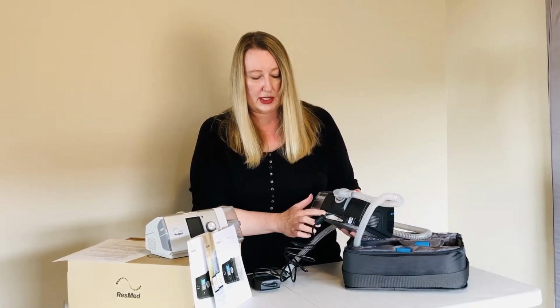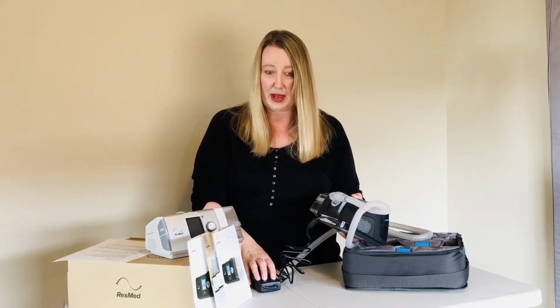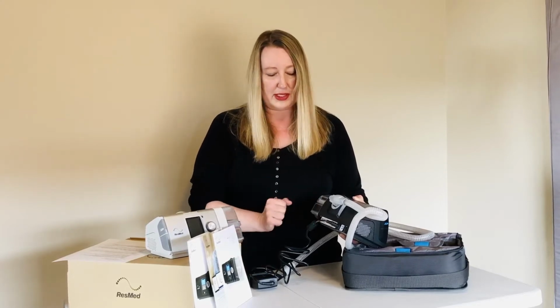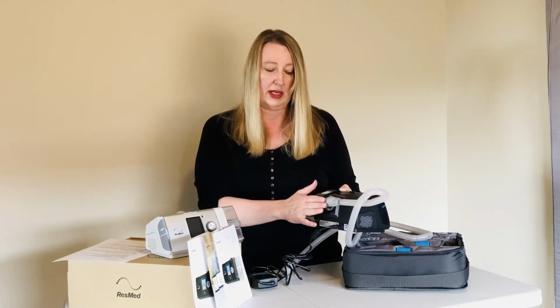You will also notice the serial and device number located on the back of the unit. Please keep the power block on the floor towards the outlet, not on the bedside table beside the unit. This is where your standard 6-foot CPAP tubing attaches.